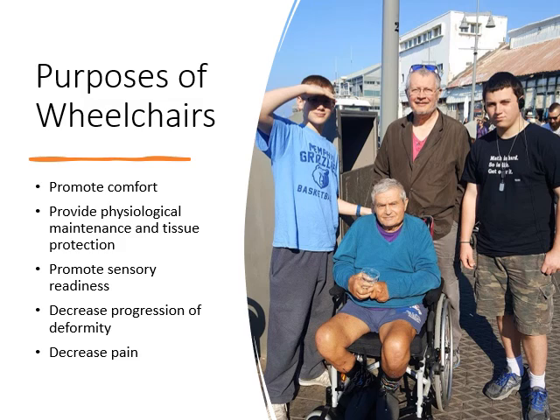The therapist evaluates the skills of the user or the client who's going to be using the wheelchair, their ability to develop new skills to use a wheelchair, and any changes that are expected from the diagnosis. Of course, the therapist also is going to consider the environment in which the wheelchair will be used, and we'll talk a little bit about that moving forward.